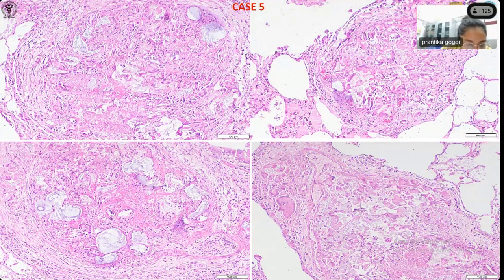Yes. What is this? Someone has said that the lights are not moving. One second. The lights are not moving? Not moving, yeah. Can you see these four pictures? Four pictures are there. Yes, sir. So this is the arrow. So you can see what structure it is, which has got smooth muscle in the wall and contains the RBCs in the lumen.